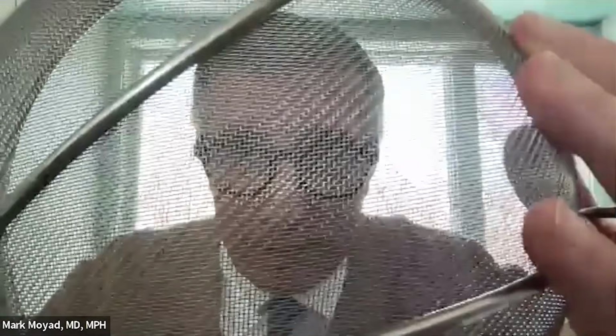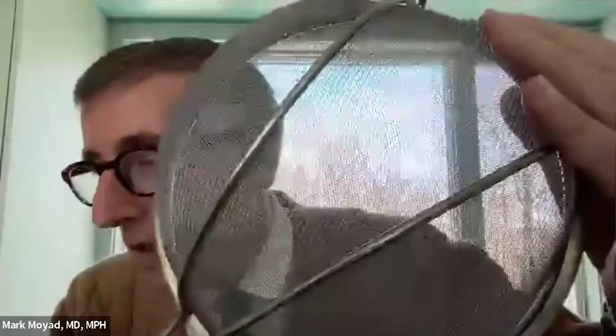Why was cribriform named sieve-like? Why does this remind me of a kitchen utensil? Right. So if you were to zoom in on that sieve, it's basically something with little holes in it, little punched out holes in it. Yes. And so that's what it ends up being. I like the analogy of Swiss cheese in a sense, because that's what it kind of looks like. It's a solid sheet with like somebody took little things and punched out little holes in it. Here, they're tiny little holes. It doesn't quite look like that, but yeah.